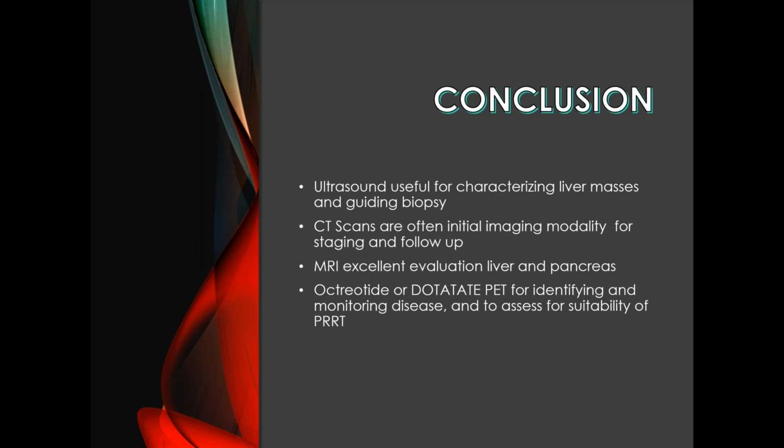Okay, thank you. And with respect to CT scans, why is it some patients are asked to drink a liquid before they have a scan, but others aren't? And this is, I'm assuming, not for lung CTs. Yes, exactly. So that's the oral contrast, and that oral contrast is used to basically fill up the bowel and help us evaluate the bowel.